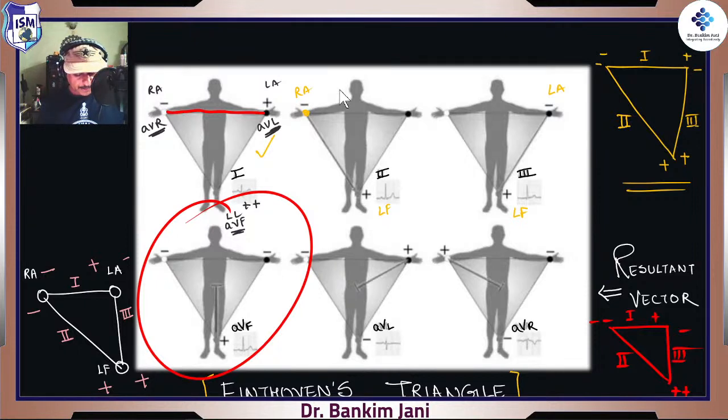Here, that's the point, okay? Now, if I put two vectors, right? You know that we have just put 3 electrodes on our patient's body. So whatever is to be done, it has to be done only from those 3 electrodes, true? Okay, so in this case, here is one electrode and here is this second electrode, right? And we are on the foot. We are now measuring from the foot, right? This is the direction where we would like to watch.